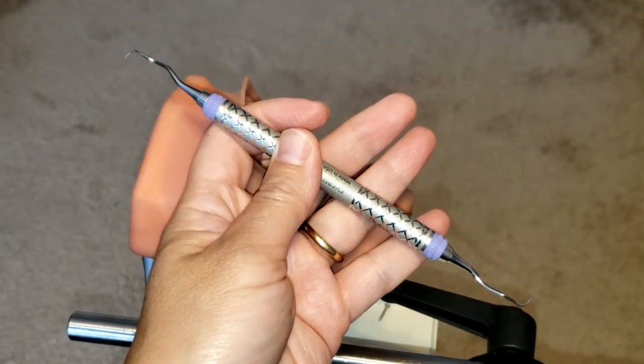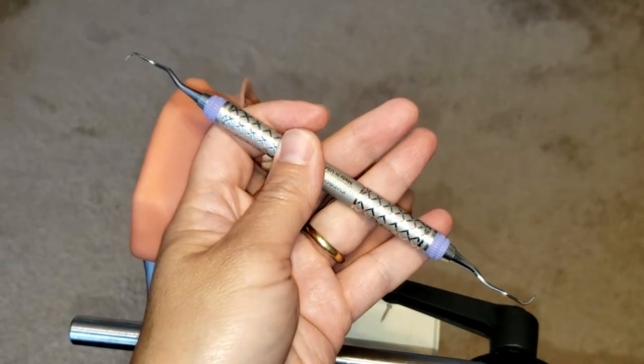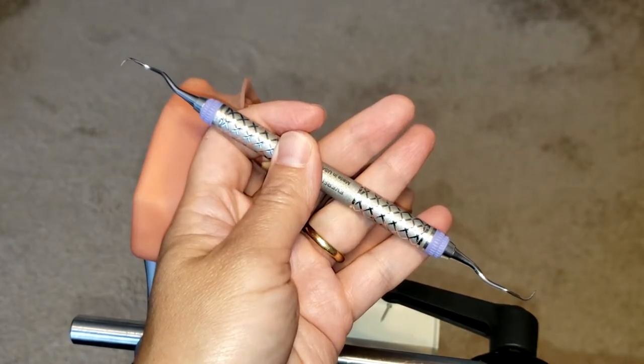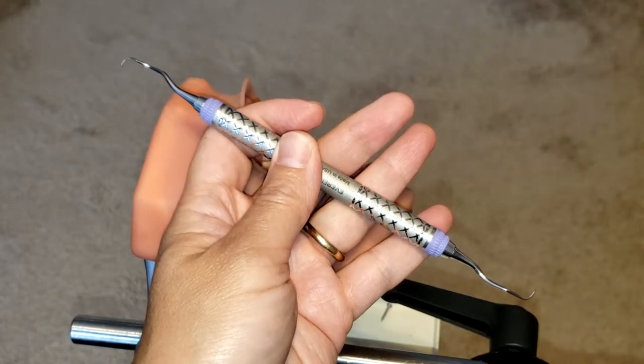Hello everyone and welcome. Today I'm going to be showing you how to use the Gracey 13/14 curette. This is a periodontal instrument that is area specific for molars and premolar use only on the distal aspects of those teeth.